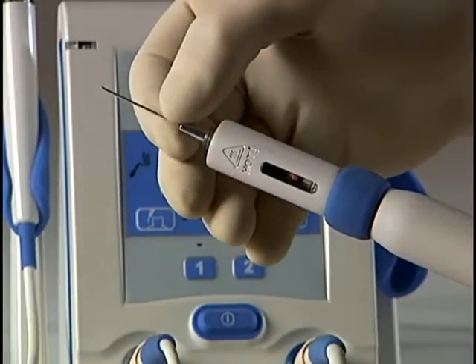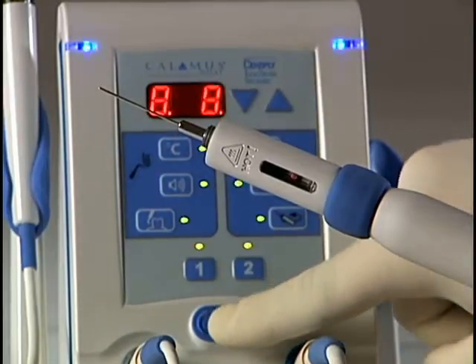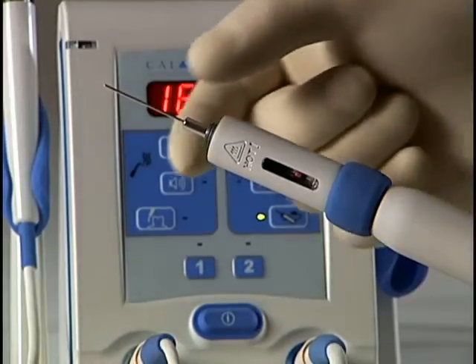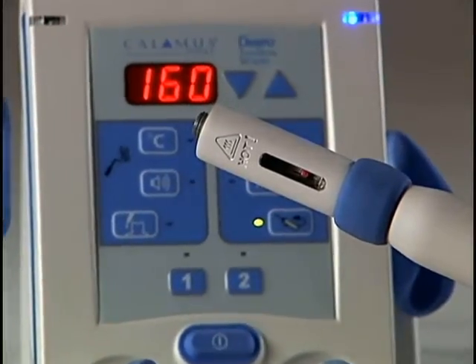If the cartridge is not fitting completely into the handpiece, carefully power up the control unit and press the return button to pull back the plunger.